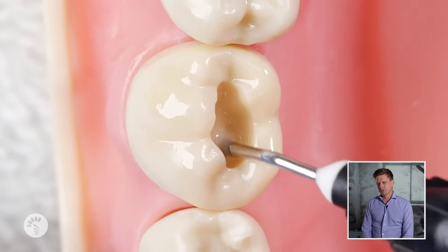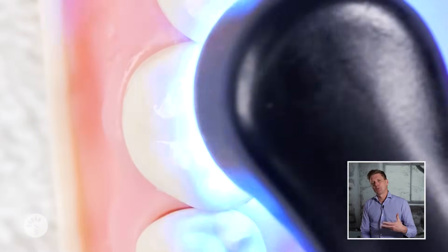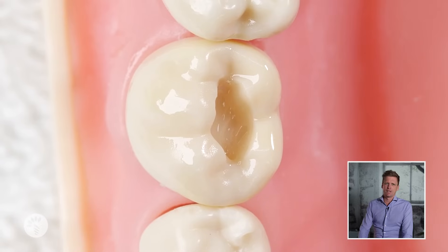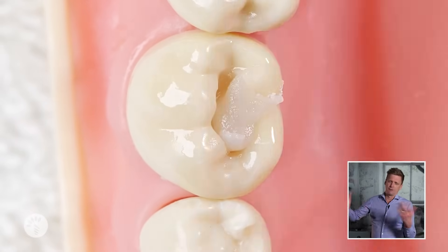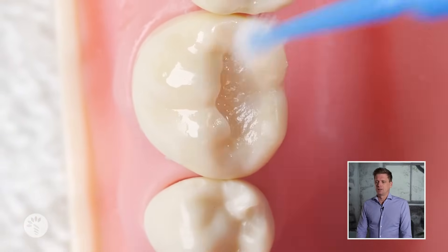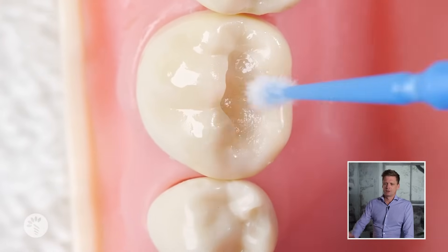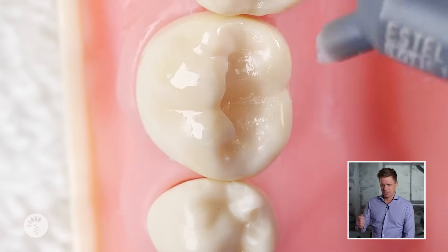We cure, and then the initial stages are the same: put flowable in the base of the cavity, cure it to reinforce the base layer, so there's less chance that shrinkage pulls the bond off the dentine — which causes post-operative sensitivity, pain on biting, sensitivity to hot and cold. For really deep cavities I'll do multiple layers of flowable as the full base filling. Flowable is fine as long as it's not under tensile strength or heavy occlusal load — it's totally fine to fill three quarters of the cavity, you just don't want it supporting a marginal ridge. Here I've filled both lingual cusps with one load of composite, and I'm still using the same shaping technique because it's actually faster than adjusting the occlusion later.